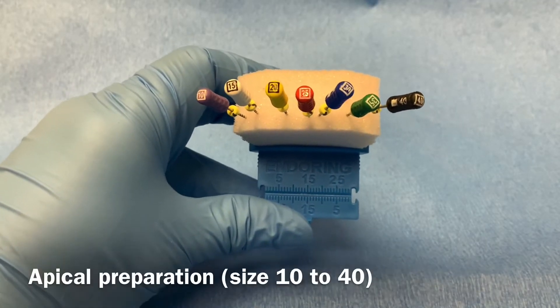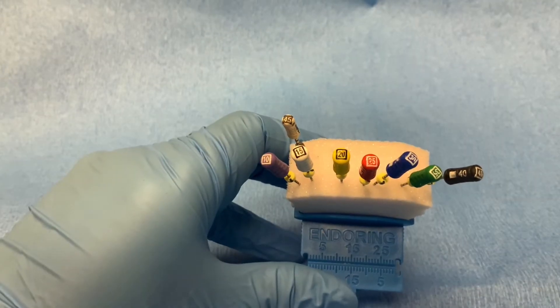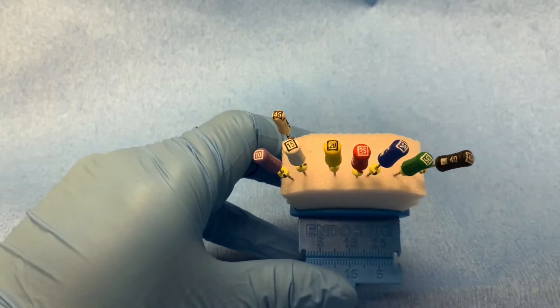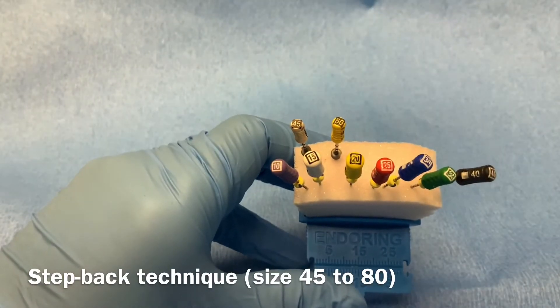First we will do apical preparation of the canal using size 10 to 40 k-files. Then we will clean and shape the remaining portion of the canal using the step-back technique by using larger size k-files, 45 to 80.